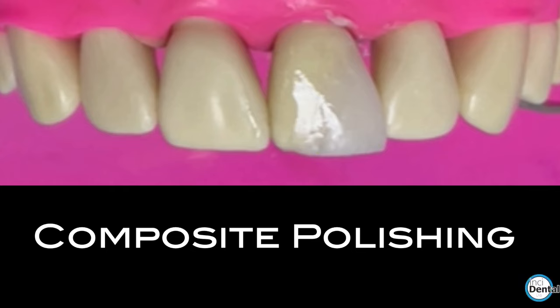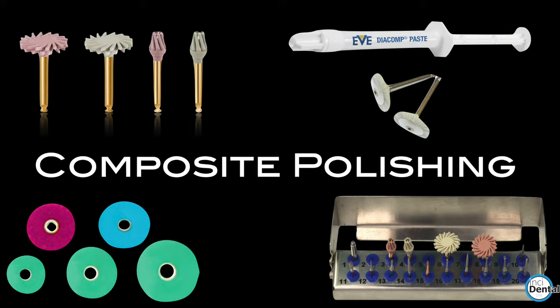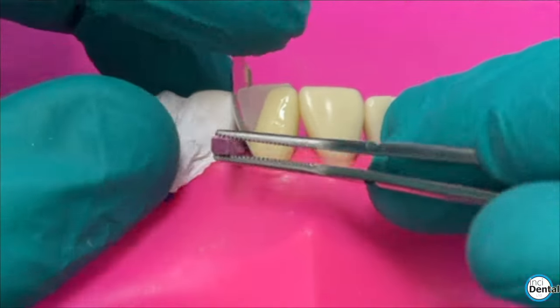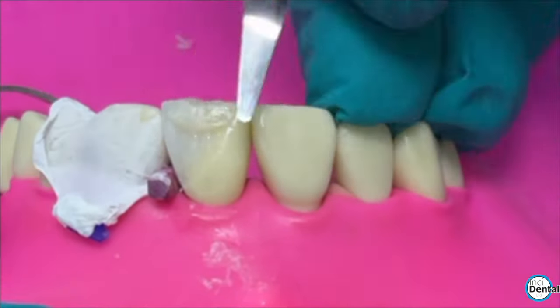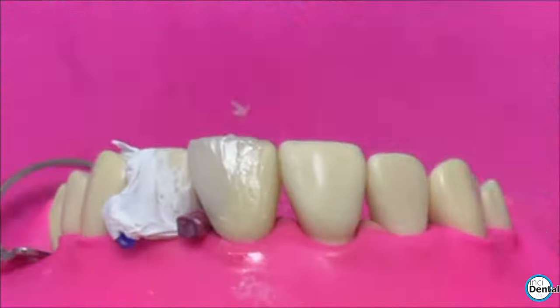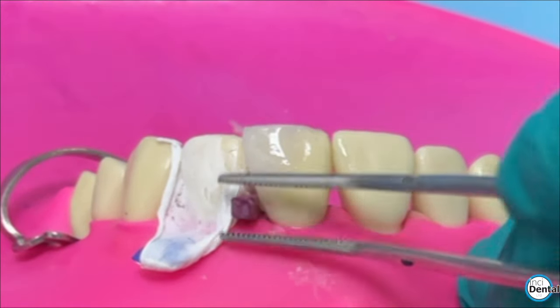In the previous video we did a demonstration of a polychromatic class 4 composite restoration. What we're going to do now is continue the story — on that same build-up we're going to do a polishing demonstration and show you some of the equipment we recommend and retail at Incidental Limited and how to get the most out of it. Quick recap: last video we showed how to add multiple layers and build up the class 4 restoration. We didn't mind over-building it a little, but we wanted enough to polish and contour. So let's continue and do the polishing procedure.